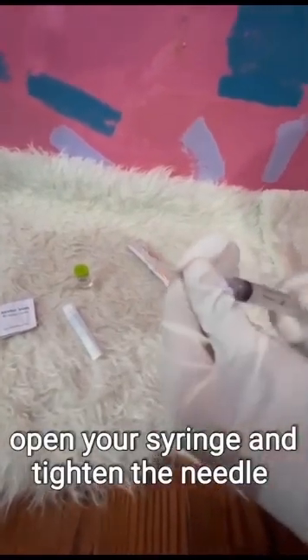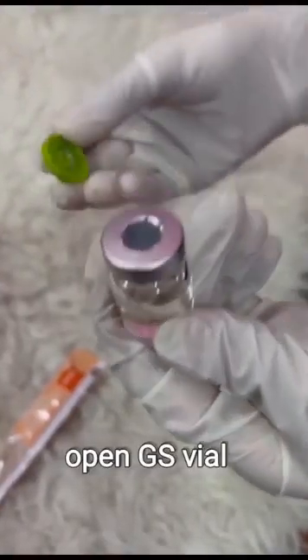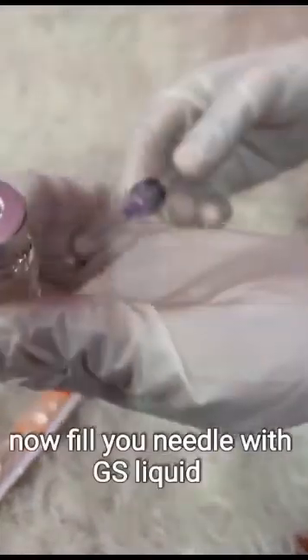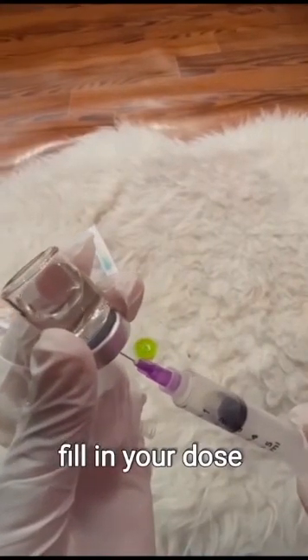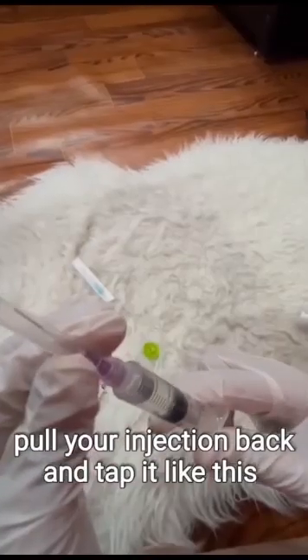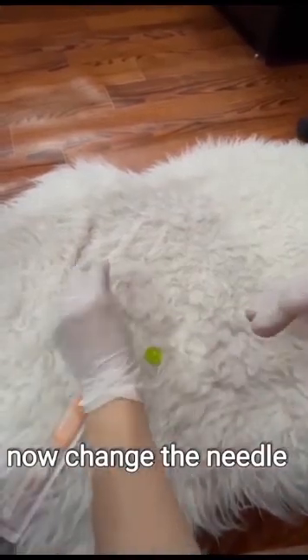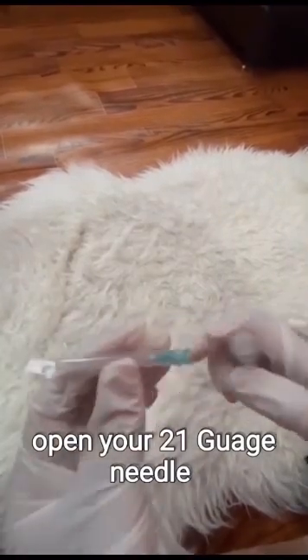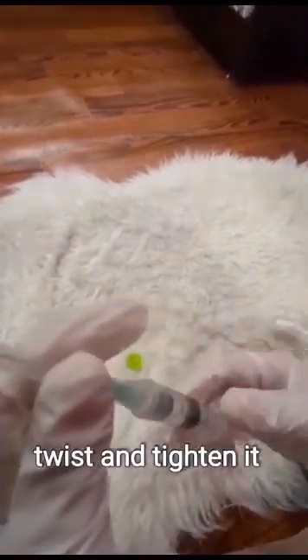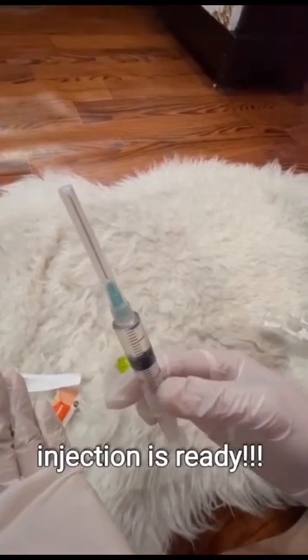Open your syringe and tighten the needle. Open the GS vial. Now fill your needle with GS liquid. Put your needle in the vial at a 90-degree angle. Fill in your dose. Pull your injection back and tap it. Now change the needle — open your 21-gauge needle, twist and tighten it. Slowly pull back the injection. The injection is ready.